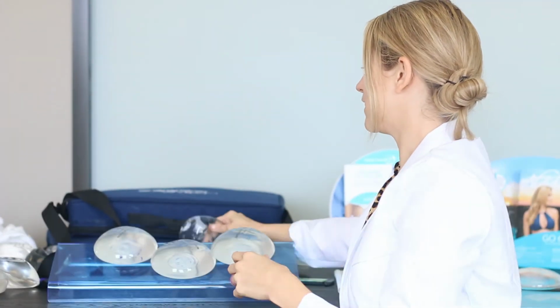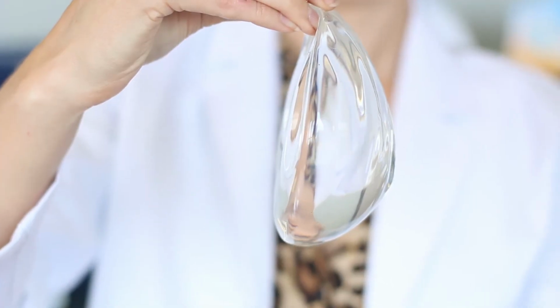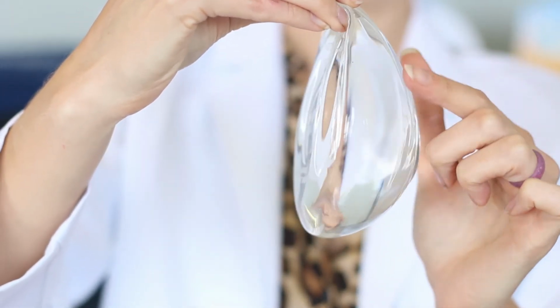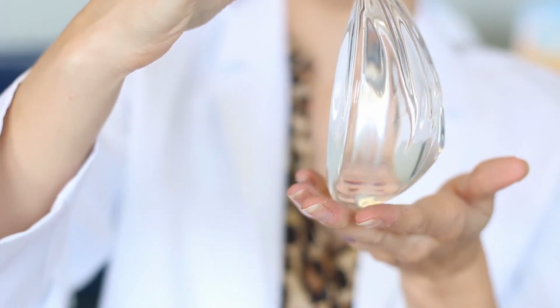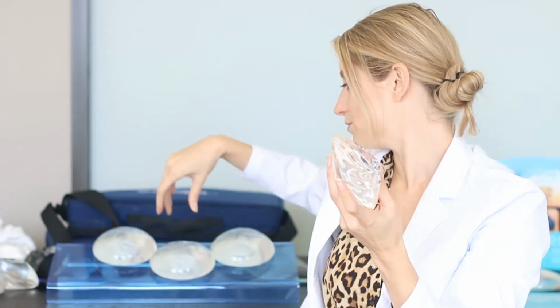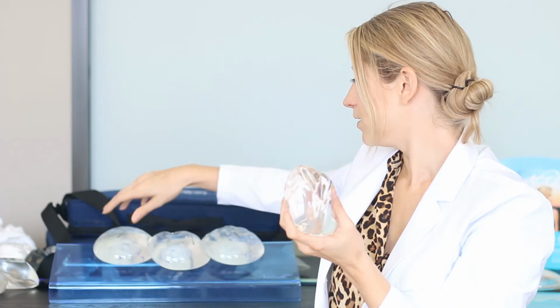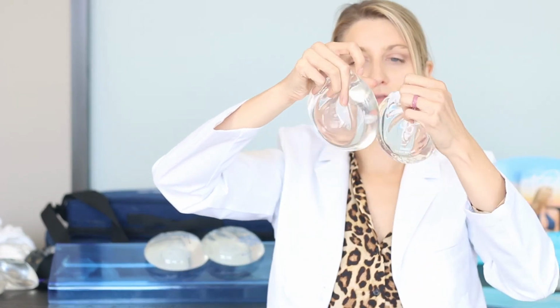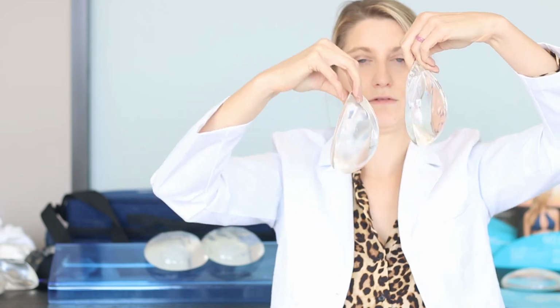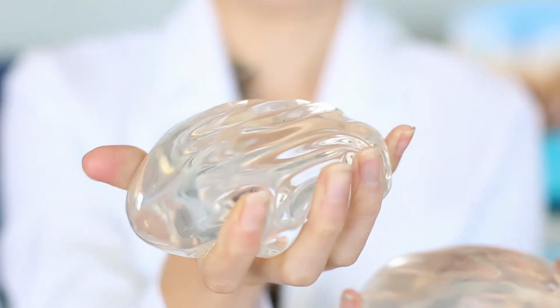There's one other implant that I do like to use, and this is the Sientra implant. I feel like this is a very good in between for some of those. Whenever I hold this one up, there is a little bit more rippling right there, but it also gives you more projection. So if you have nice good coverage of your tissues, this is a great implant to use. I feel like it's very similar to the responsive as far as the amount of rippling and the amount of teardrop that's shown. You can see there. But this one is a little bit softer whenever you squeeze it versus the soft touch.